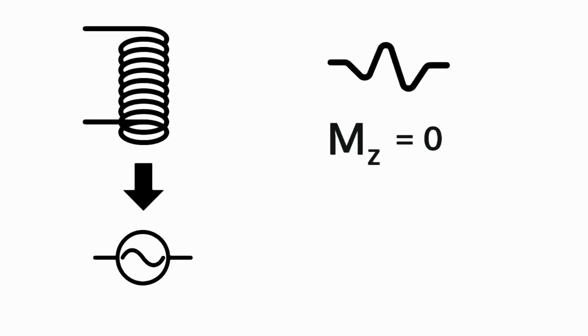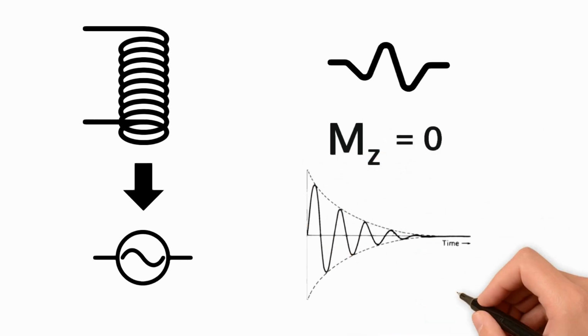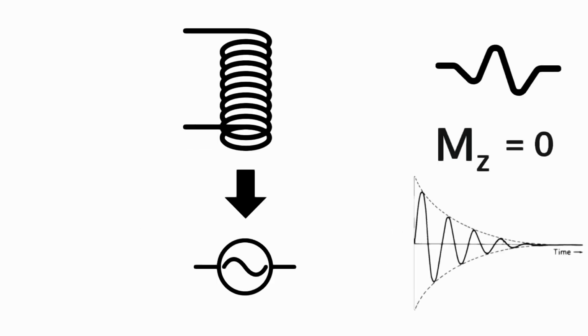This maximizes the amount of coherent signal we get before the relaxation mechanisms make M return to being aligned with B0. The signal that we get is a sinusoidal wave of constant frequency, but exponentially decaying amplitude. For just one proton not interacting with anything else, this frequency should be the Larmor frequency.